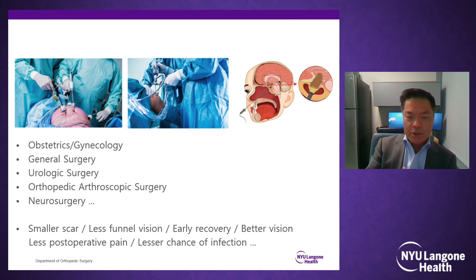There's a picture, to your right, where you're sticking a scope up someone's nostril and taking out a tumor in the, I think it's the brain. Yes, in the brain. And then obstetrics, GYN, and general surgery also use scopes. So the common theme is that endoscopic surgery leaves smaller scars, less postoperative pain, better recovery, and obviously less chance of infection given the fact that you're operating in a closed environment and oftentimes with significant amounts of irrigation.